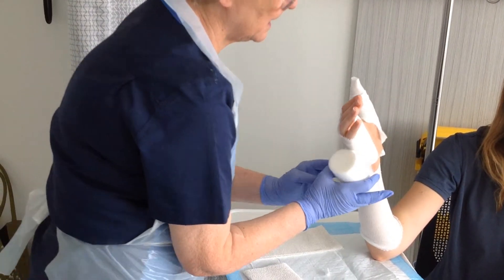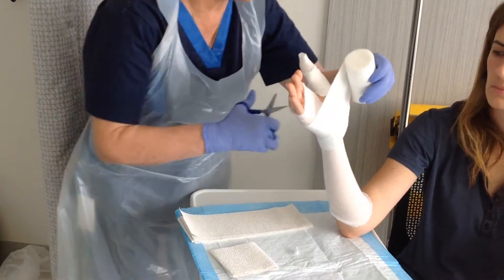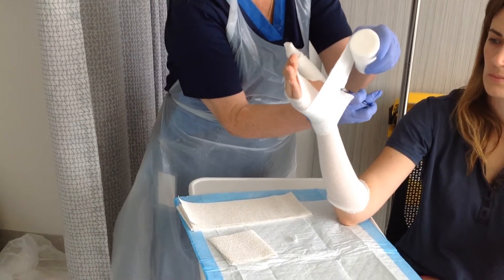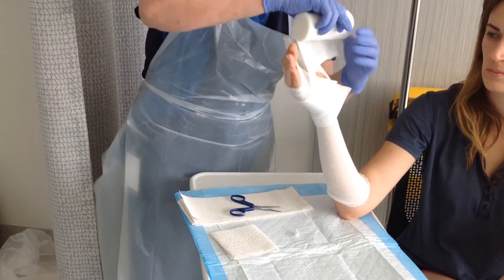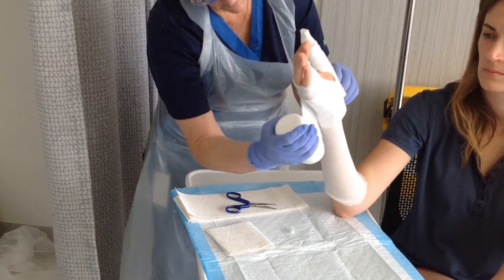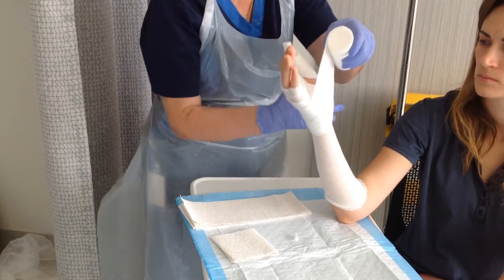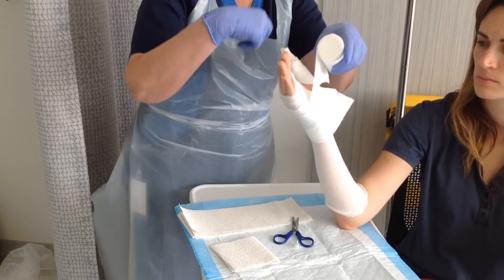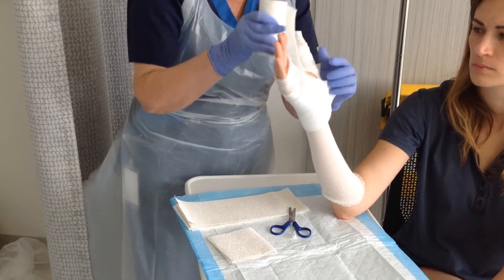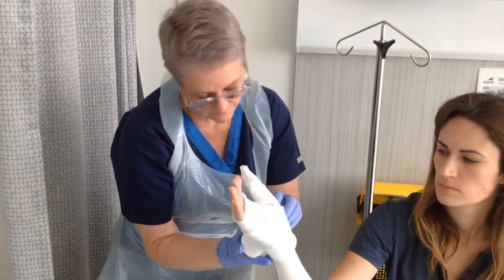Bring the padding around the back of the hand and then to the front of the hand. We take the scissors and from the patient's side we cut at an angle almost to the end of the stocking, then wrap that around. As you can see, we need to come round twice. For every wrist splint or below elbow cast, the padding needs to come round twice.